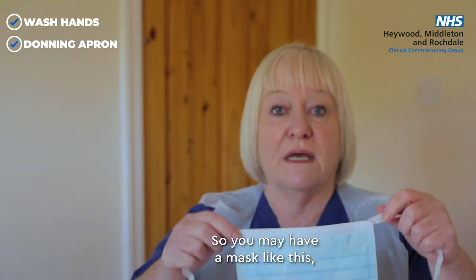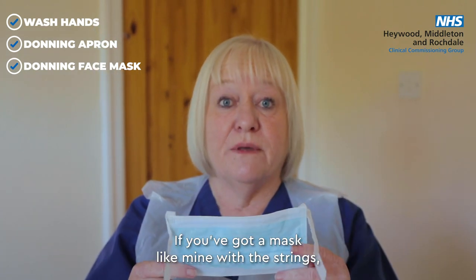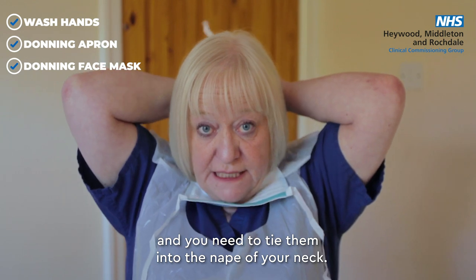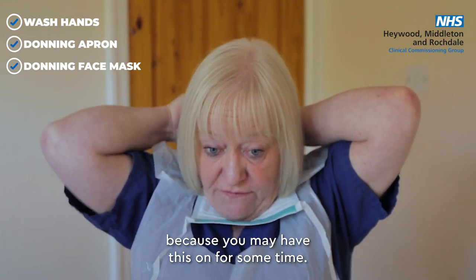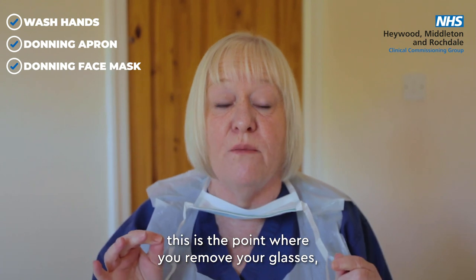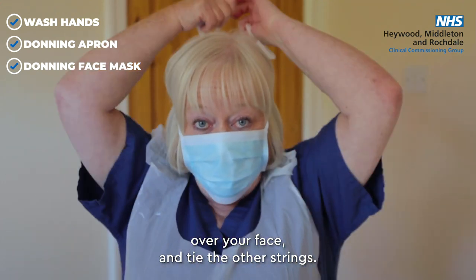You may have a mask with strings or one with elasticated sides. If you've got a mask with strings, take the bottom strings first and tie them into the nape of your neck — nice and secure but not too tight, as you might have this on for some time. If you're a glasses wearer, remove your glasses and place them on a clean surface at this point. Then pull the mask up over your face and tie the top strings.